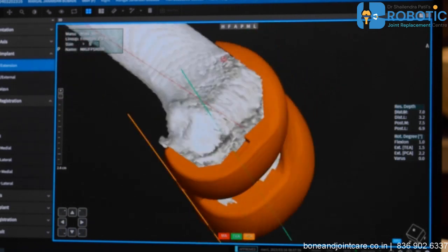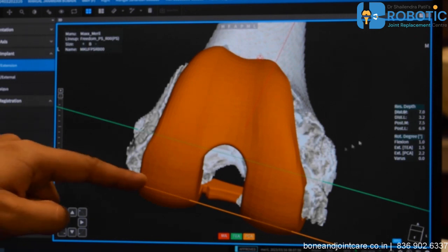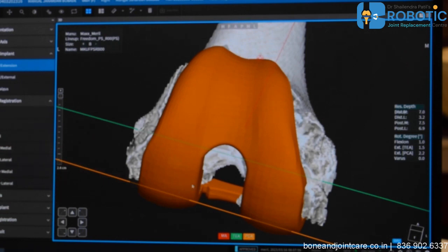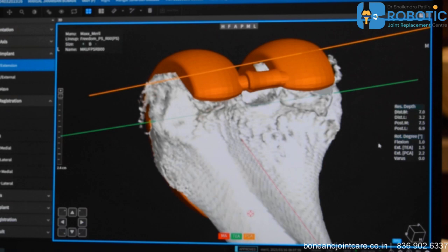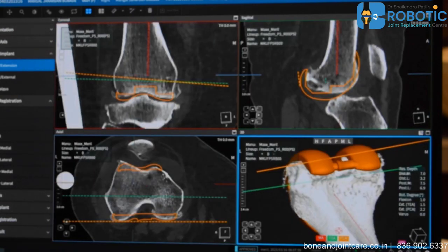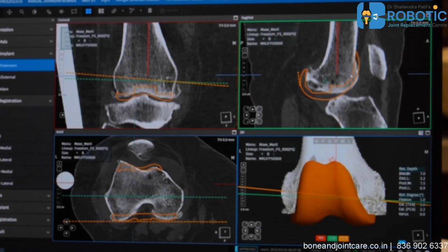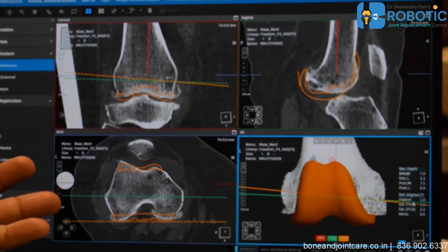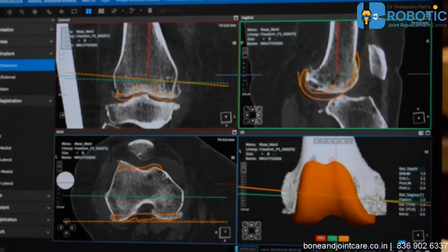There are system-generated values showing how much bone will be cut medially, laterally, posterior-medially, and posterior-laterally. The system also provides information on flexion — how much the implant needs to be flexed, or how much the patient's body demands in terms of flexion. Rotations can also be managed in these windows, allowing the surgeon to change rotations accordingly.